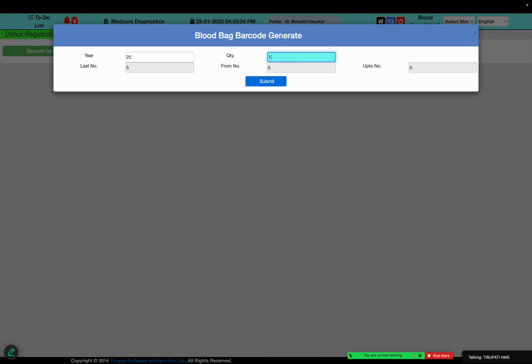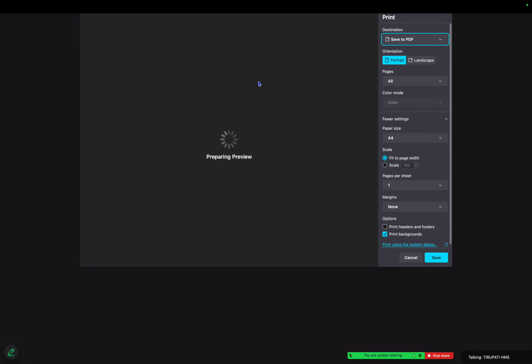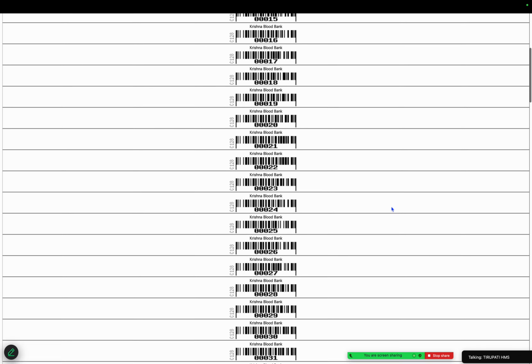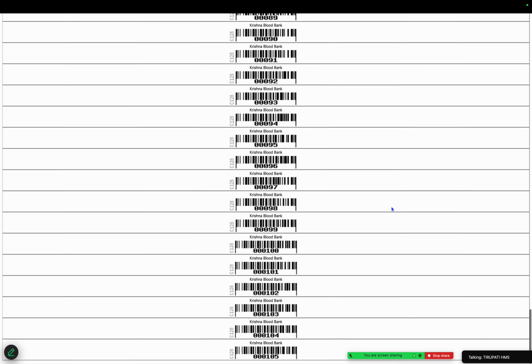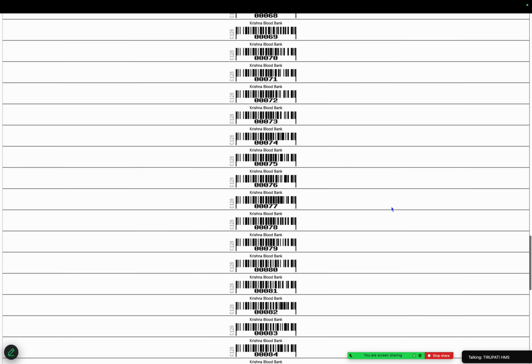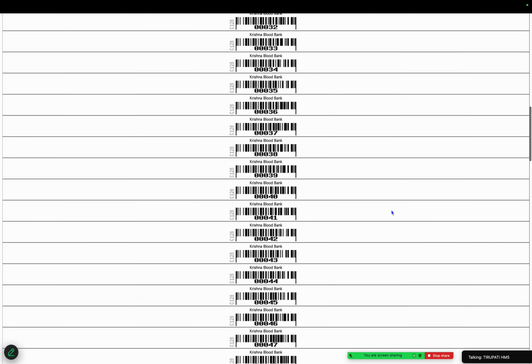So we make a 100 barcode bulk register, which can be copied: one for the blood component bag along with the donor file profile. So we can generate a bag number listing, and the barcode will be generated for 100 bag capacity. This will be punched in two copies, one for the donating bag and another for the donor ID card number, like that.